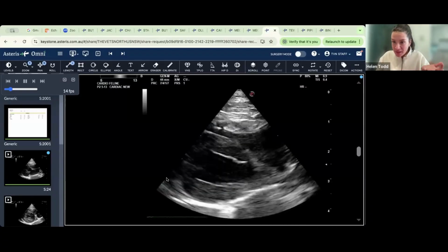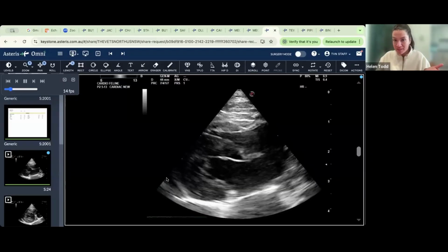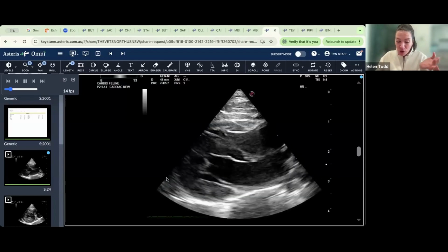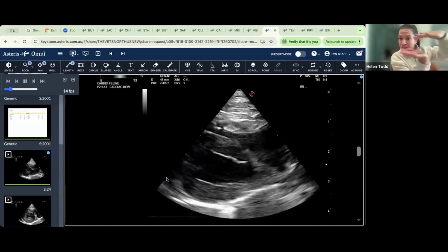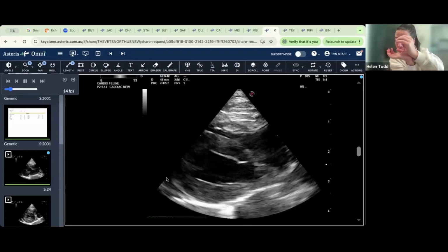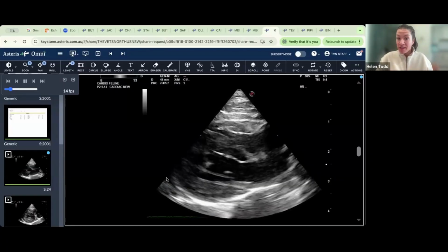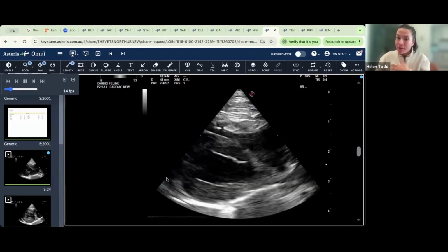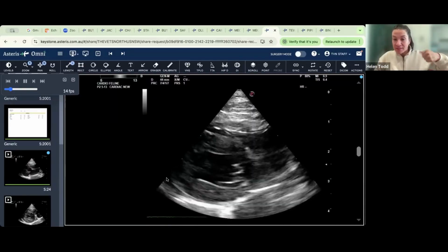And you can see when cats' hearts get marked concentric hypertrophy, this is a cat with quite significant HCM. The ventricle looks like a bit of a mess because we've got a lot of chordae tendineae coming in. We don't get this beautiful, lovely elongated ventricle that we watch collapsing anymore. They often look a little bit rounded and really, really dead. So subjectively, we could say this is a really thickened ventricle, and we only know that because we've looked at some other cine loops. I promise the more you look at, the more obvious it gets.